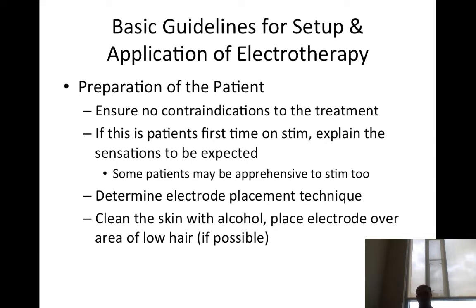Make sure the patient has no contraindications. If this is the patient's first time on an electrical stim, explain the sensations that may be expected. You might feel a light tingling sensation where the stim is applied. It will feel like bugs crawling on your skin. Some patients might be apprehensive to stim. Almost every dancer I have tried to treat with stim hates it. They don't want it. They're scared of it for some reason. It's crazy. I don't know why.